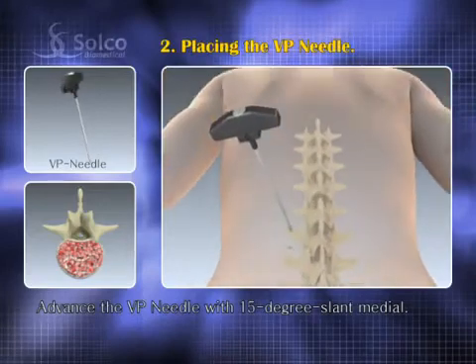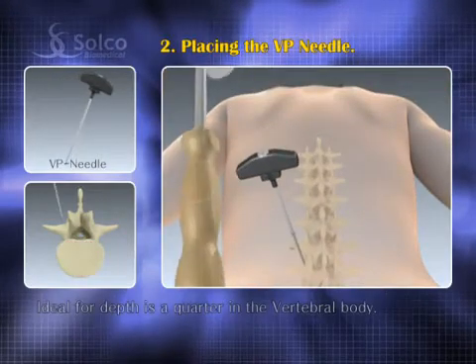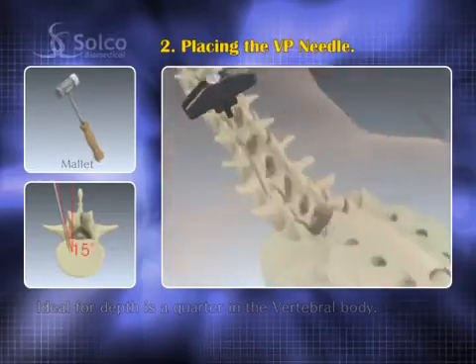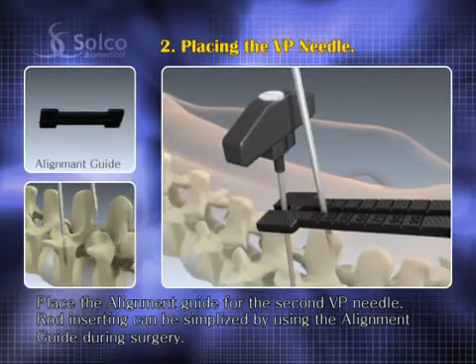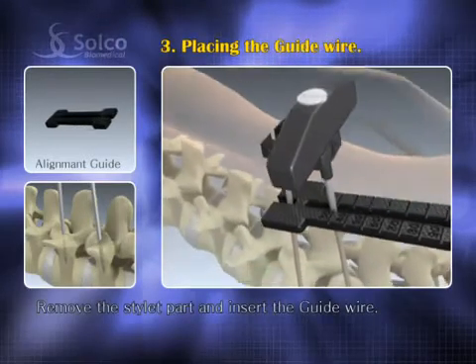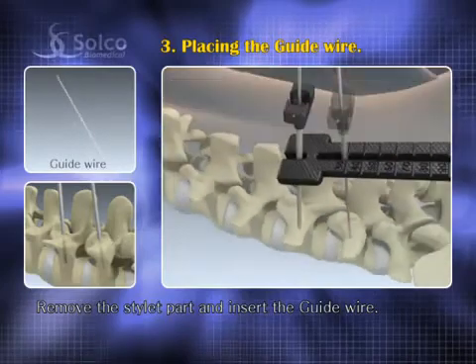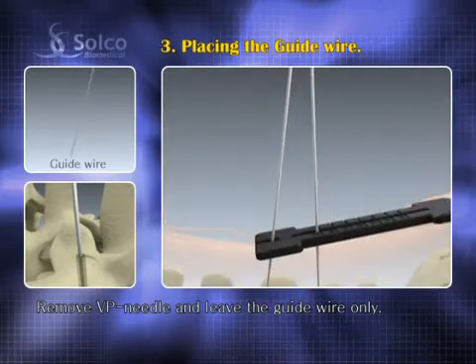The VP needle is advanced to the pedicle entry point with a 15-degree slant medial. Ideal depth is a quarter into the vertebral body. Place the open end of the alignment guide to indicate the location for the second VP needle. Remove the stylet part of the VP needle and insert the guide wire into the VP needle very carefully. Once the guide wire is properly placed, remove the VP needle and leave the guide wire only.